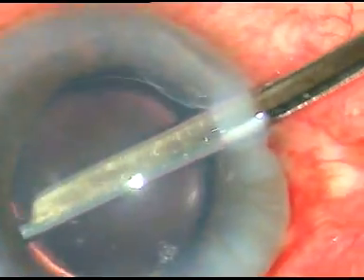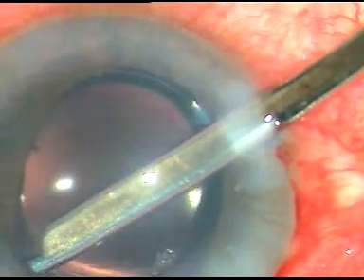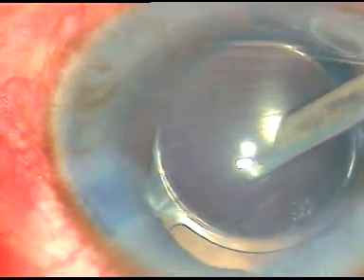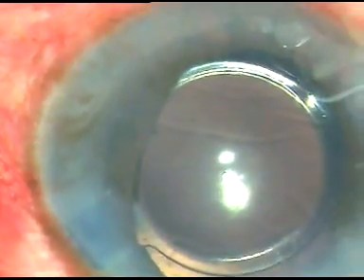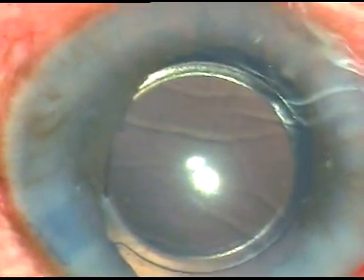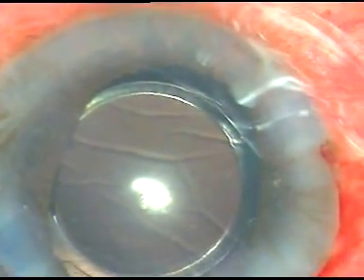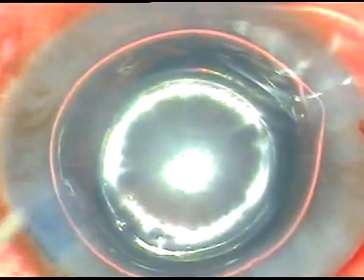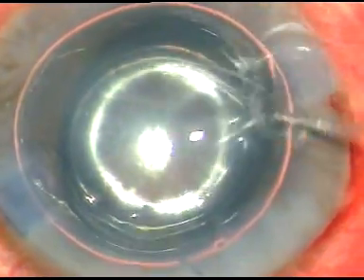If we can do PI in some cases, even then the drainage site is blocked by this clumped iris. So hence trabeculectomy is required. But if we do clear lens extraction and retract the iris towards the center, the angle will open and the patient will have normal intraocular pressure next day without medication.